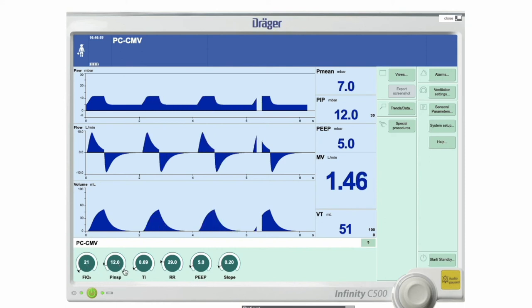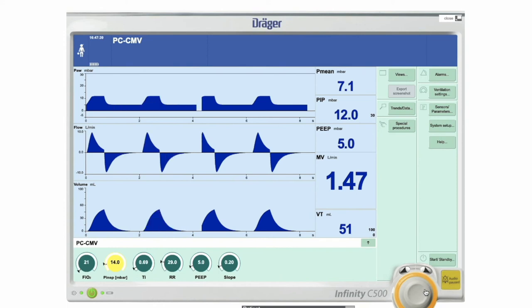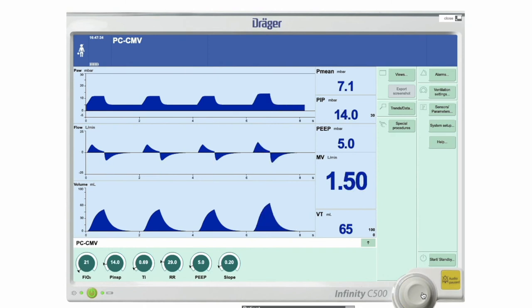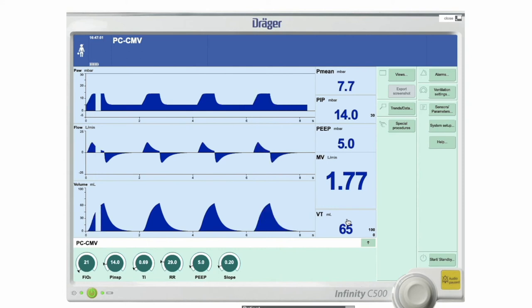If you increase the peak inspiratory pressure, the tidal volume goes up, minute volume increases, and the area under the curve — which represents mean airway pressure — increases. Increasing PIP to 14: mean airway pressure increases to 7.7, tidal volume increases to 65 mls, and minute volume increases to 1.7 L/min. You've always got to check all the other settings when you make that kind of maneuver.